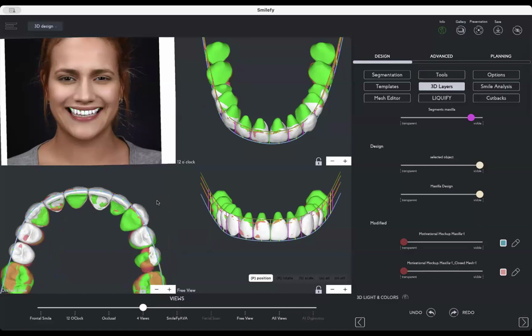Bulky pushes the lip forward. The lip is not symmetric. The patient doesn't know. The patient wants a Botox treatment to just synchronize the right and left side of the lip. It wasn't necessary. It was just the smile design, which was not done properly. And then with the occlusal curve, you make sure you follow exactly the incisal edges and the lip support of the patient.